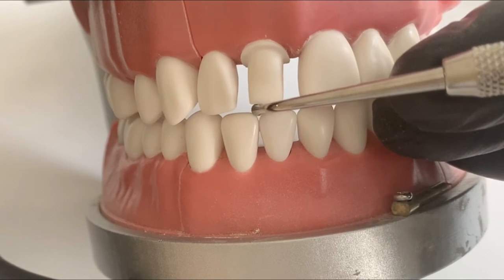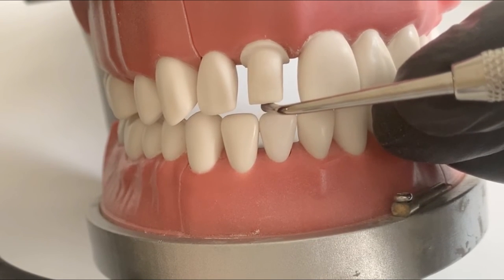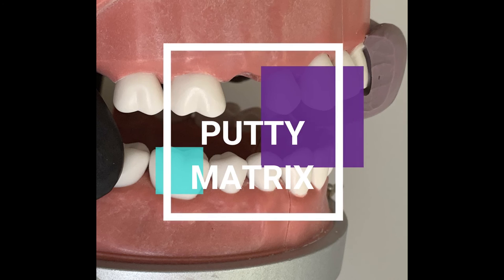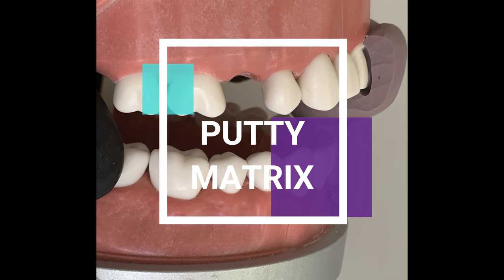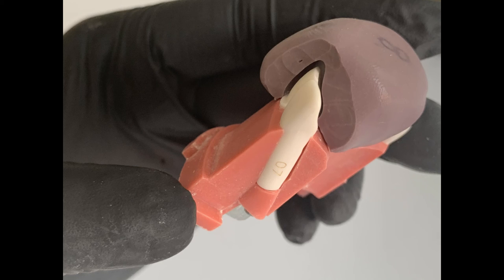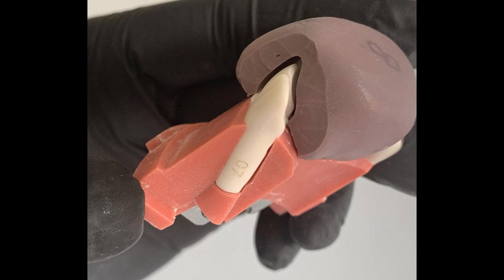One of the most important tools when you're first starting off is the putty matrix. Once you've prepared a correct putty matrix, it helps you determine if you are following the contours of the uncut tooth. Time and again while prepping your teeth, you should be placing the putty matrix over your prepped teeth to see if you're following the contours. In this picture you can see the occlusal clearance, labial contour, and palatal contour — I'm trying to achieve the same contour as the uncut tooth. This putty matrix is a tool which is next to none.